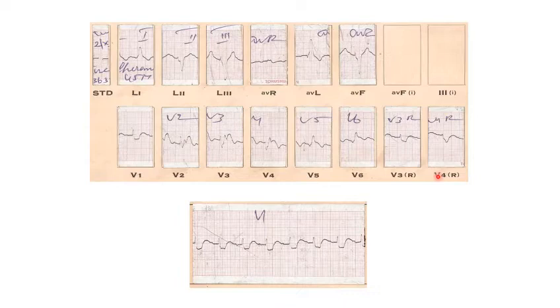Any other point? Sir, there was notching in V3, V4 on the S wave, Cabrera sign or something, which is suggestive of old MI. Is that the sign here, sir? You read about the various features which tell you how to diagnose previous myocardial infarction in a patient with LBBB. Why is it that in RBBB you can always diagnose myocardial infarction, but in LBBB there is a difficulty in diagnosing it? Why is it so?